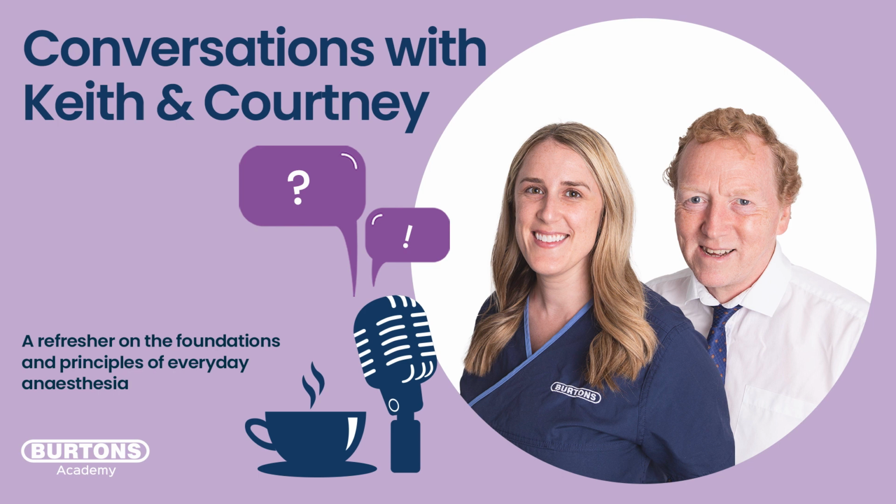So we probably want to overdo the respiratory rate because we're going to overdo the minute volume. That means we're going to tend to get rid of CO2. We're going to reduce the alveolar CO2. We're going to reduce the arterial CO2. It's going to take away the spontaneous drive.